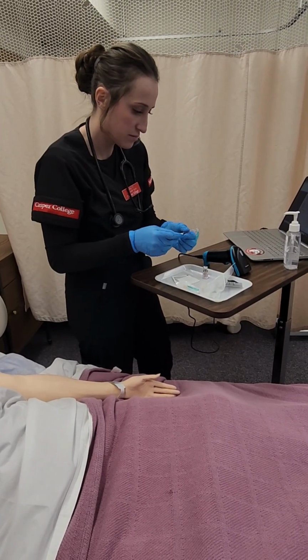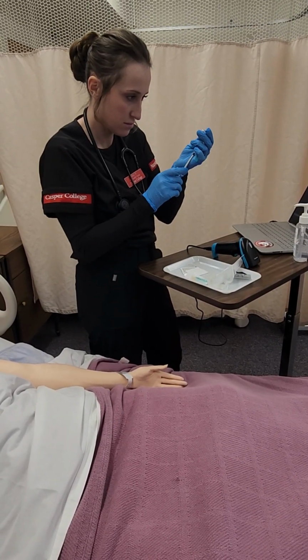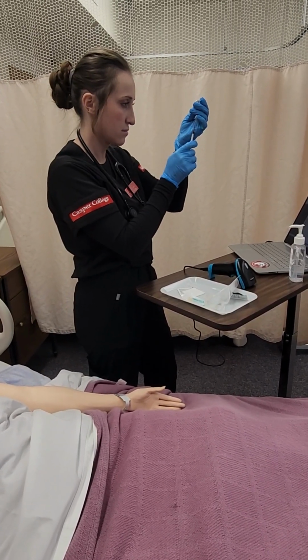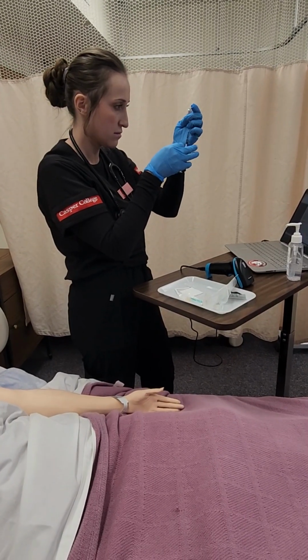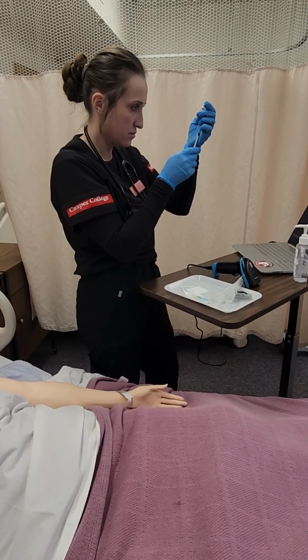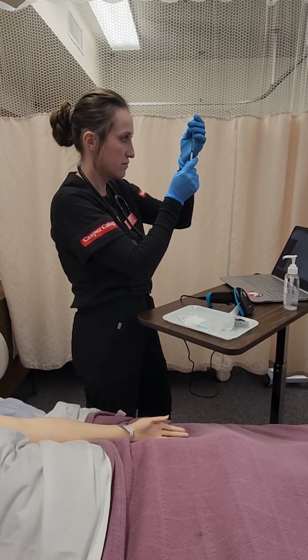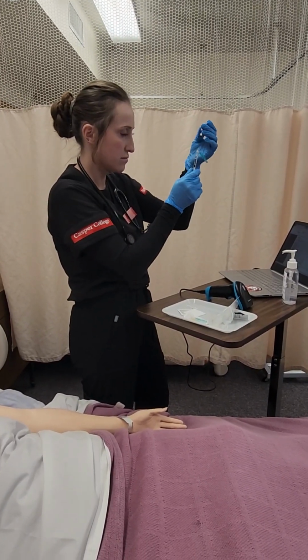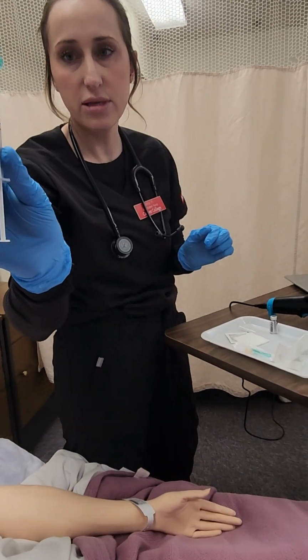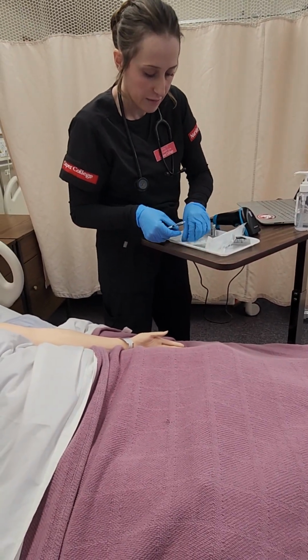Milliliters. Okay, I'm going to check with my other nurse that I have 0.5 milliliters. Yes. Okay, and then I'm going to do my third med check.